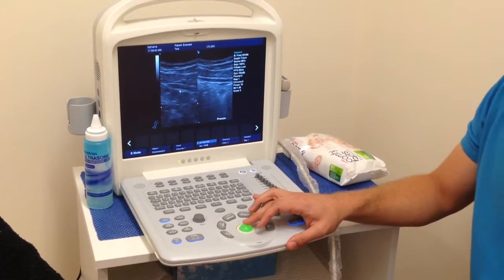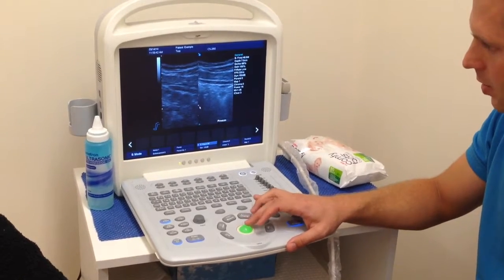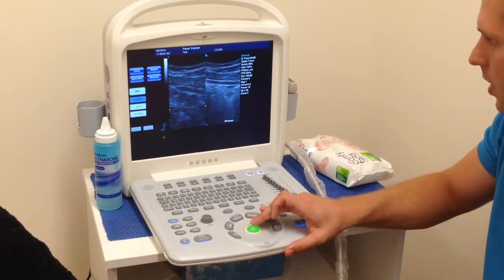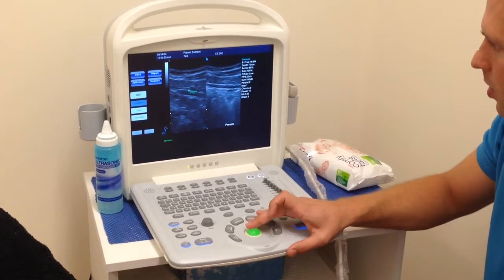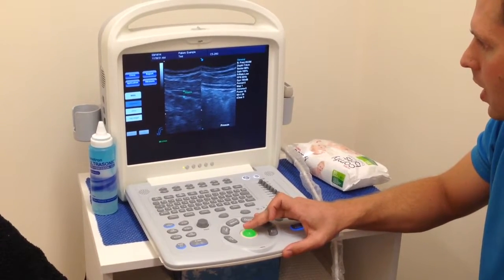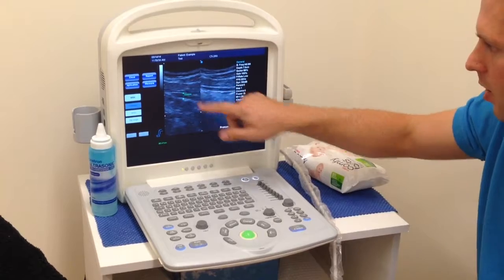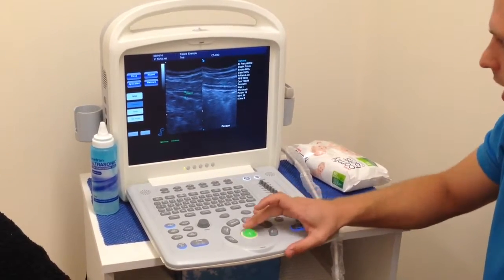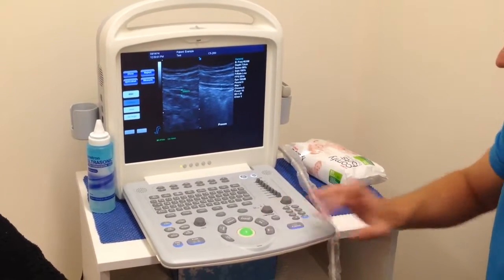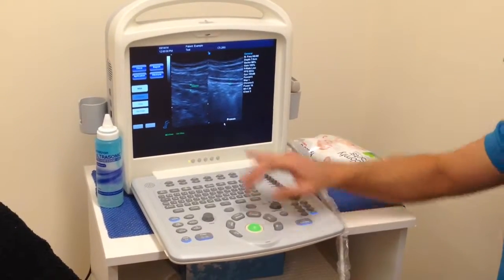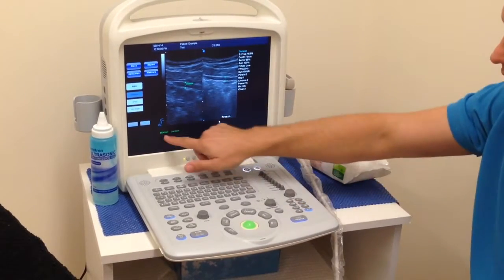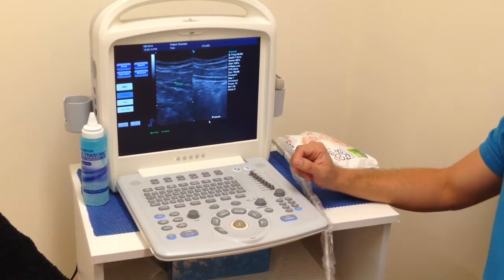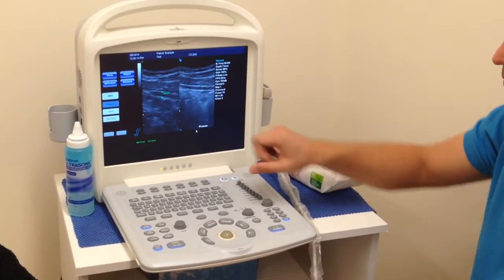I think here we can see that on Ben's left it's a little bit thicker appearing in this image, but we can actually measure that. Selecting our distance here — set here to here. The internal oblique also looks a little bit thicker on that side. Setting that there, and then we're going to set the middle of the muscle belly on the other side, and it's significantly different: 5.47mm compared to 4.1mm on the right-hand side. And sometimes you see that with people who have a lot of one-sided problems.